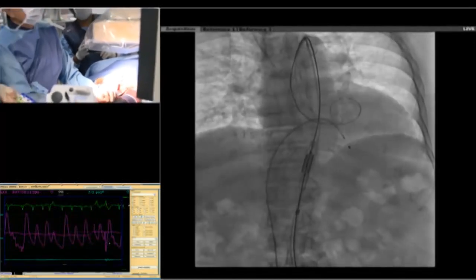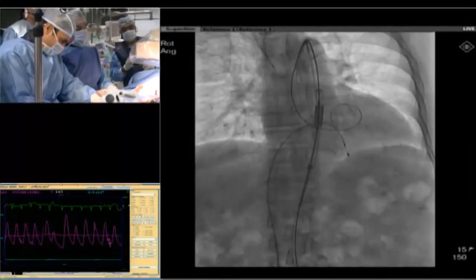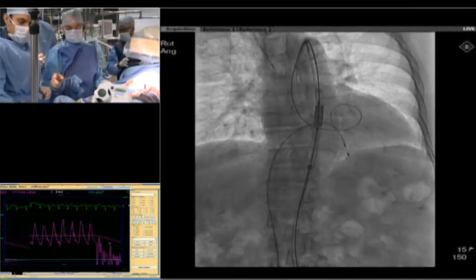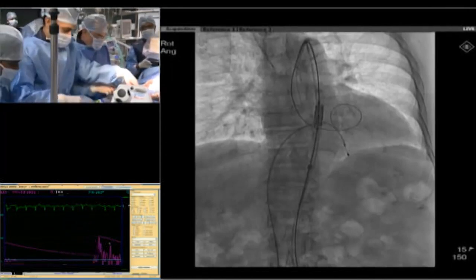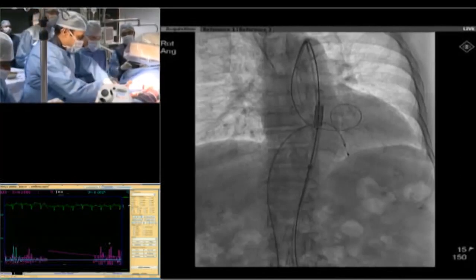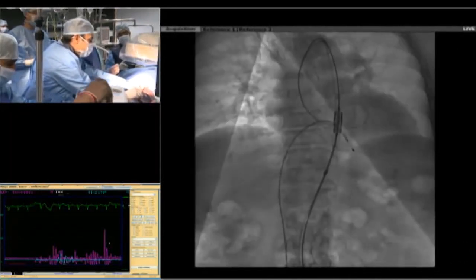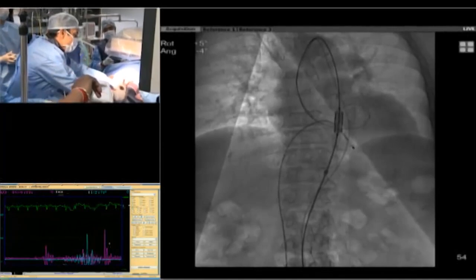Let's go. Now let's put our pigtail in position. And now we connect to the ventricle. So here you can see the navigator catheter. You can flush, please. There would be some resistance going. You might have to use the navigator catheter. So what we can do is connect the blood pressure to the sidearm of the sheath. Yeah, we can do that. I'll have some blood pressure. And I want the wire now to go into the root of the... I think we are already there. Okay. Can I have a bit of contrast in my hand?